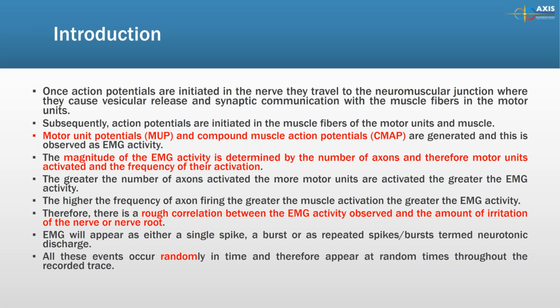So we can tell by looking at the EMG activity, if it is very high amplitude and short duration, that the irritant is of much higher magnitude.